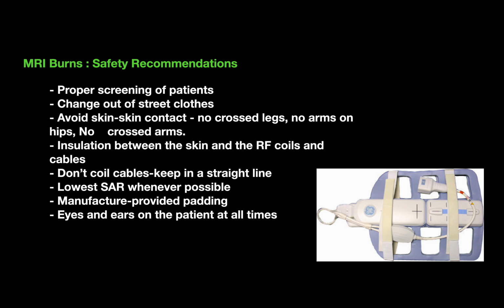So what are the safety recommendations? Proper screening of patients, change out of street clothes, it is better to give gowns to the patient, avoid skin contact, no crossed legs, no arms on the hips, no crossed arms.